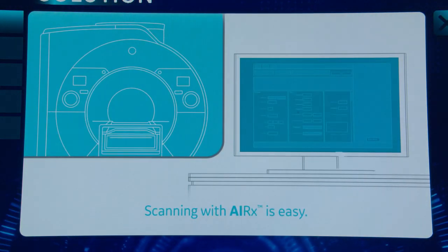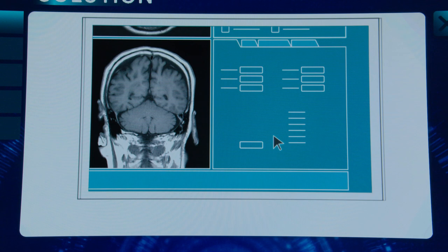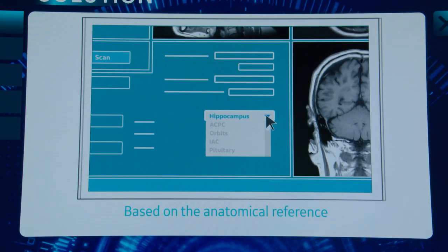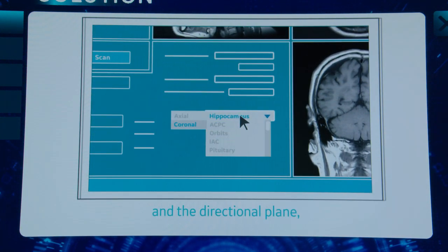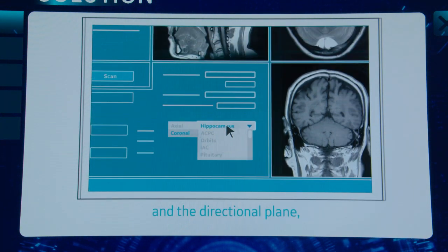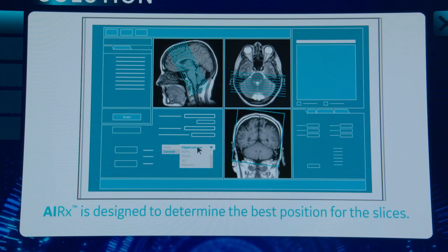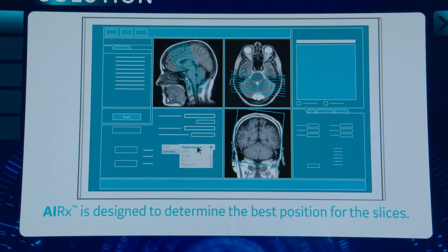This animation is showing how the technologist's workflow is really easy. They just select the protocol, and based on the anatomical reference and the directional plane from the protocol, the software determines the best position for the slices. This is really exciting because GE is leading the way with this software using deep learning algorithms to create the technology.